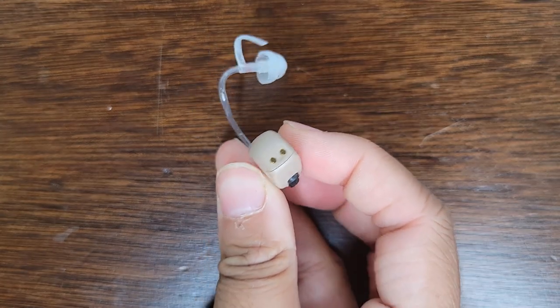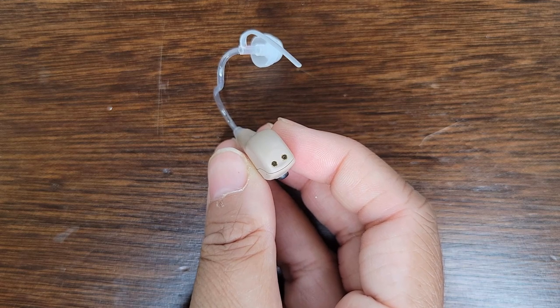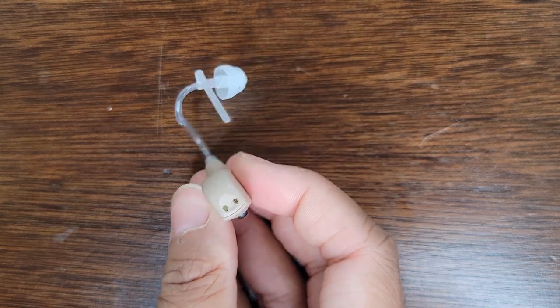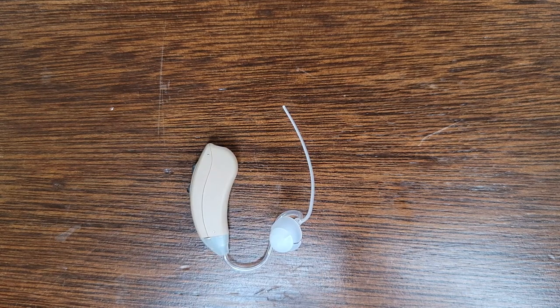Lastly, we have our charging indicator on the bottom, and you just use your charging dock to charge it. Before the first use, make sure that your hearing aids are charged and ready to go. And after that, you can just download the app. So we're going to do that right now.